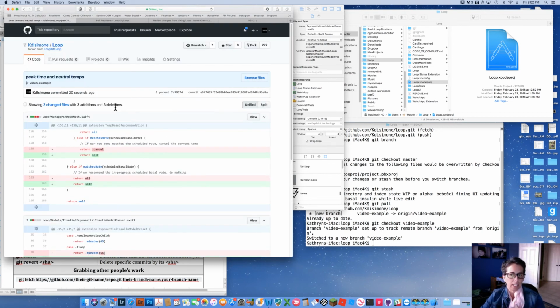And that's why Git is so powerful, is it's telling you exactly what lines, what code, who did it, when, and it's very specific. So it's not like just saving the whole project over. It's committing exactly which lines changed and how. So that's just an overview.